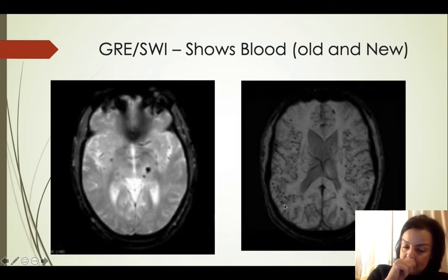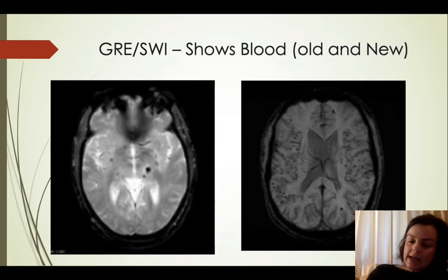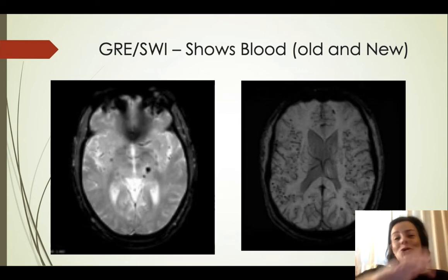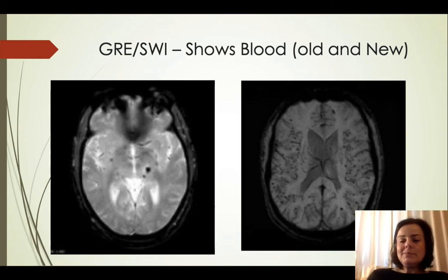We talked last time, just as a little aside, about how with intraparenchymal hemorrhages, when they are in the lobar area, out in the lobes, we wonder about something like cerebral amyloid angiopathy, especially if it's an elderly patient. Sometimes these sequences can help us tell if the patient has cerebral amyloid angiopathy, and this is a probable case, where you can see the temporal lobes especially are just kind of littered with these little microhemorrhages.